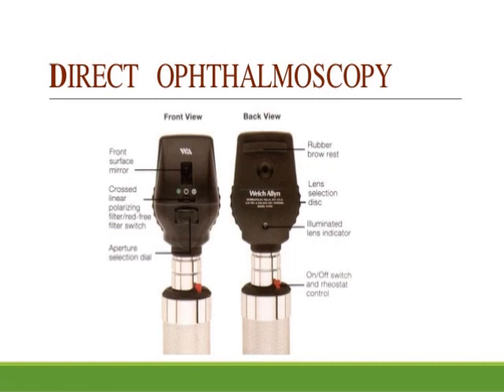The observer should reflect a beam of light from the ophthalmoscope into the patient's pupil. Once the red reflex is seen, the observer should move as close to the patient as possible. Once the retina is focused, the details should be examined systematically, starting from the blood vessels, the four quadrants of the background, and the macula.